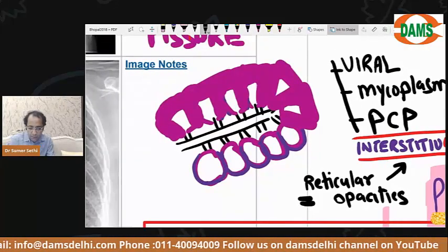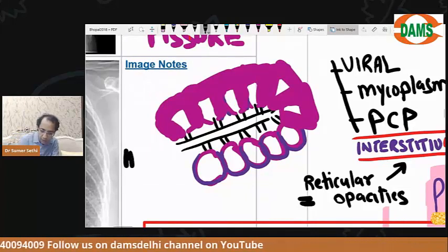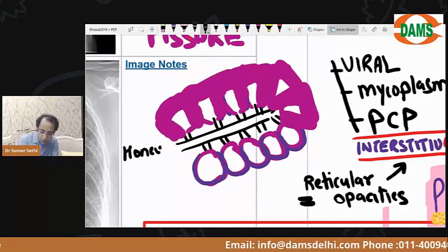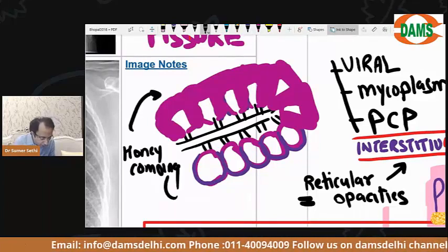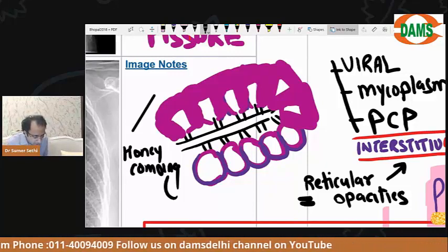So ultimately, when this develops, it becomes irreversible damage, which we call honeycombing. Are you able to understand this? Which we call honeycombing.